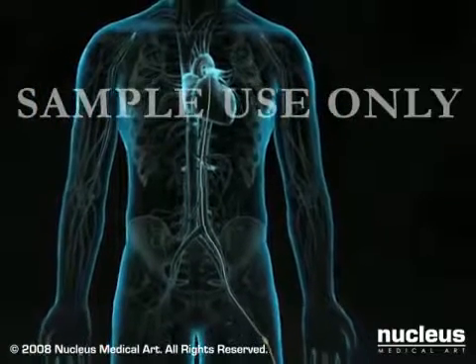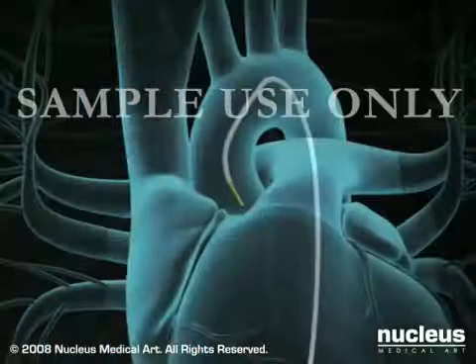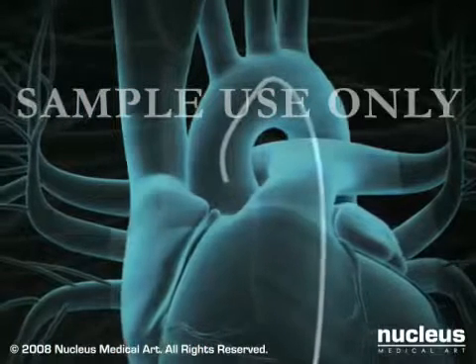But you will not feel their movement inside your arteries. At this point, your doctor will remove the guide wire, position the tip of the catheter just inside the coronary artery to be treated, and inject a special dye. The dye allows the fluoroscope to take x-ray images, called angiograms, of the artery's interior.